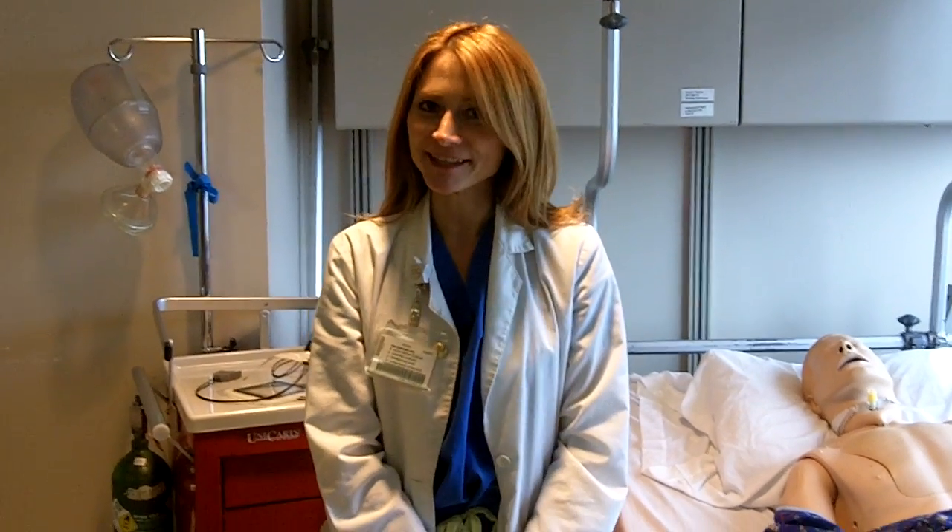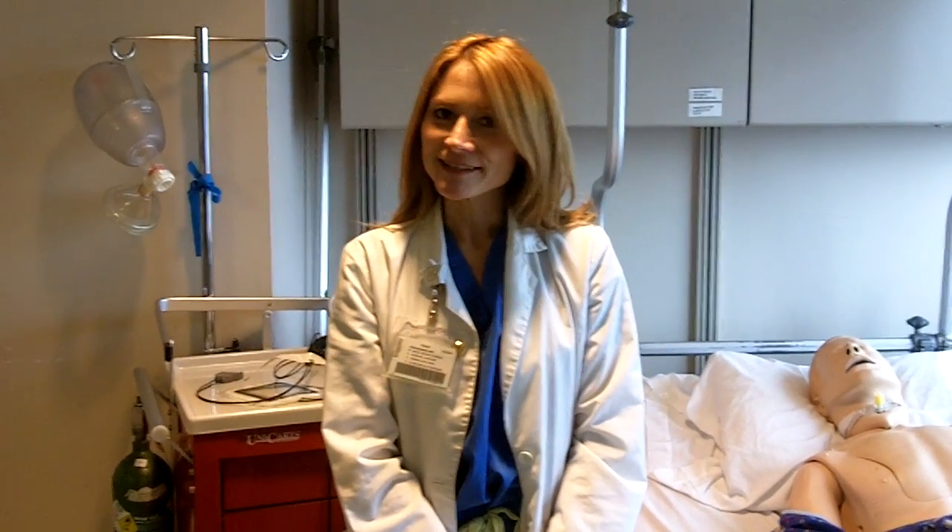Welcome. I'm here to demonstrate how to provide transcutaneous pacing to a patient with extreme bradycardia who is symptomatic. Transcutaneous pacing is a non-invasive procedure for pacing.